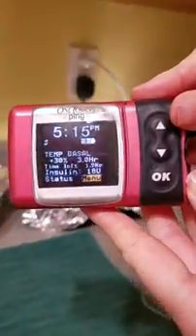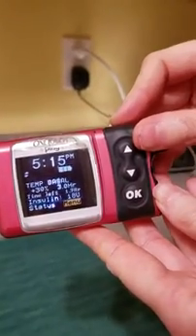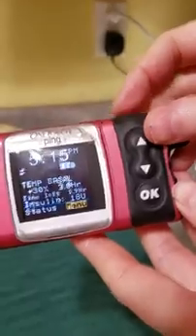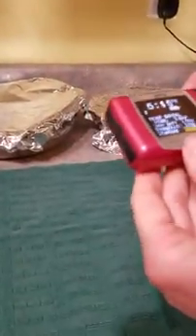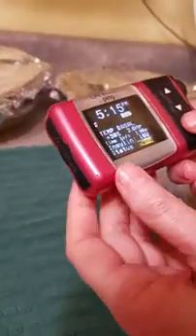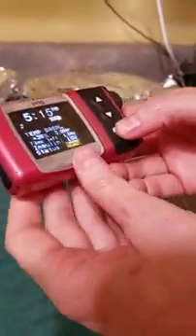There's 18 units, and I like to change it when it's between like 13 and 20. I just feel like it works better when I don't let it get super low. One time it completely ran out, and that's another reason why I don't let it get super low, because I don't want her to run out of insulin.